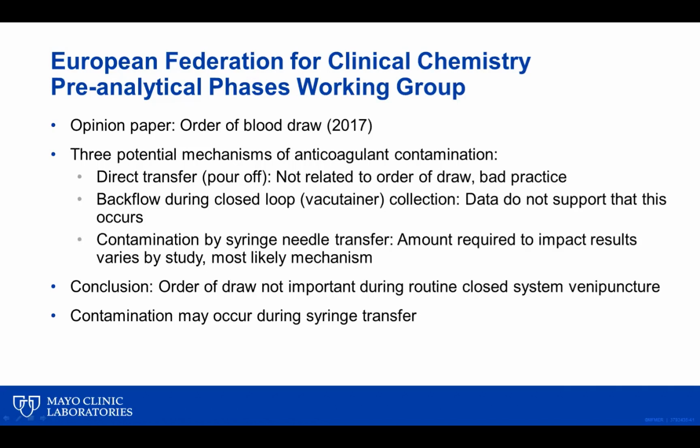The next would be backflow during a closed loop or a Vacutainer collection. So if you snap the potassium EDTA tube onto the Vacutainer adapter, there is a potential for some blood that has potassium EDTA on it to stick to that adapter, and that could get transferred into the next serum tube. And we're going to show you in a minute or so that the studies really don't suggest that actually happens with the lyophilized or the solid potassium EDTA. And this is what may have changed going to these plastic tubes where you have that lyophilized reagent or anticoagulant. So we really don't see that there's carryover from backflow on a Vacutainer adapter.